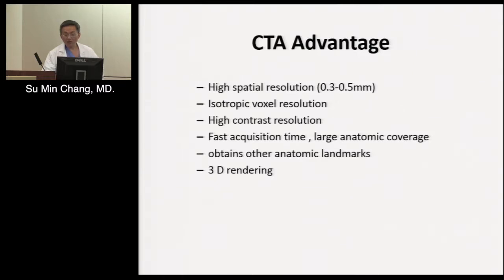But traditionally in our non-invasive imaging training, we look at the heart like echo, from a 2D perspective in different orientations, which has nothing to do with how the surgeon approaches it. I think we should learn more about how we display and read these images and how our referring physicians see them, to improve communication. CT offers a tremendous opportunity to orient the structures of the body exactly the way the surgeon sees them, so the information obtained will be much more useful for the referring physician.